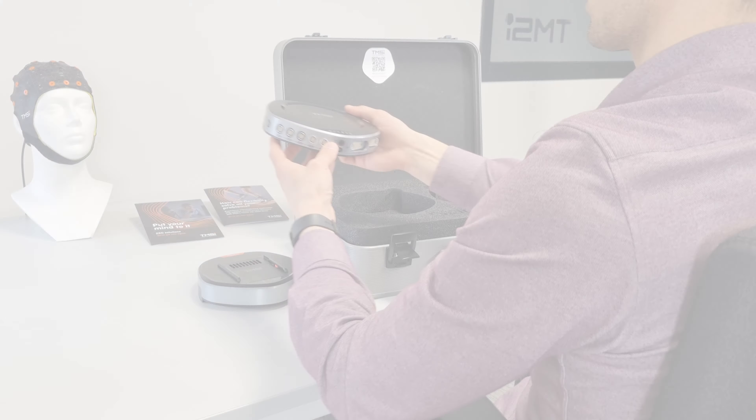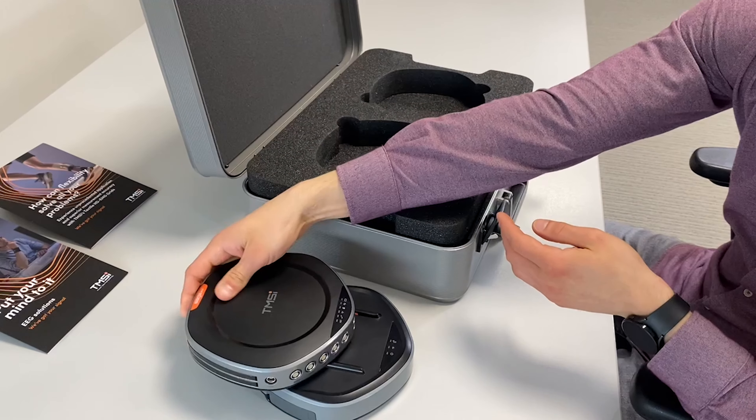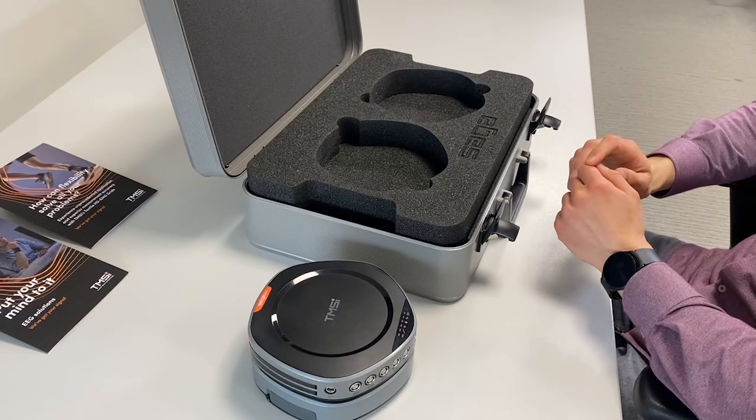To connect the data recorder with the docking station, align the gutter on the data recorder with the rail on the docking station and slide the data recorder on top of the docking station.